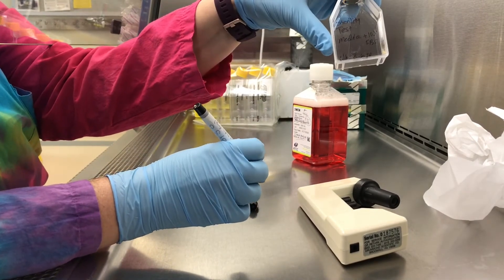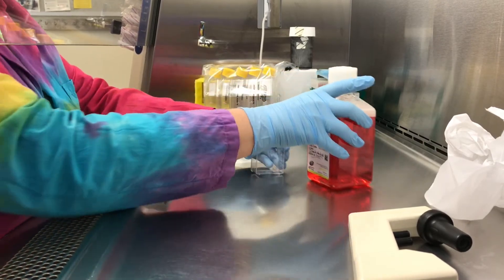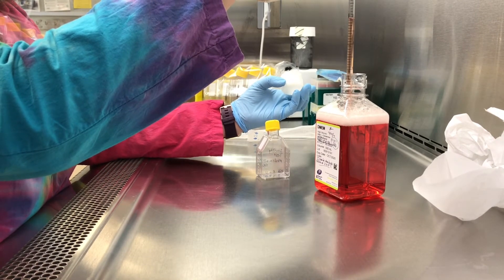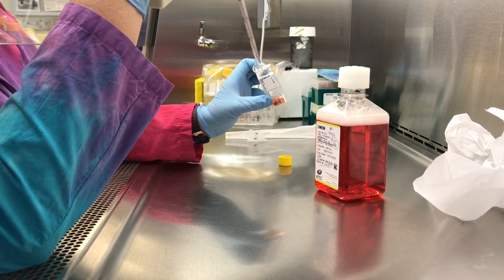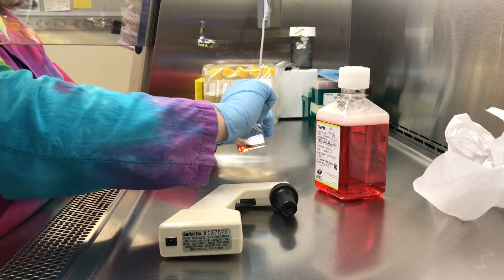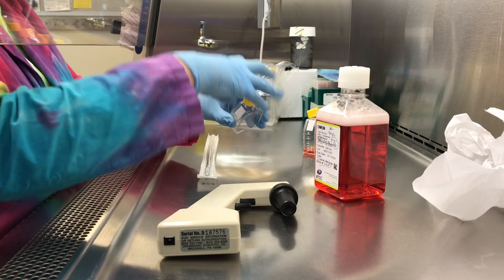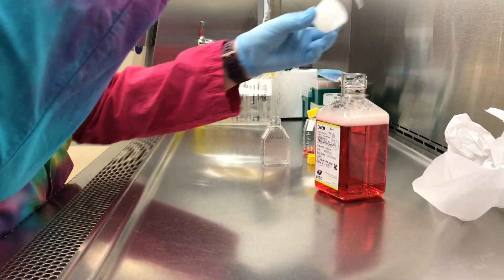As I pipette the media into the sterility test flask, I realize part of my finger may have touched the inside of the cap — and that's really all you need for a contamination event. So I'm not convinced that's going to be a reliable sterility test. I grabbed another T25 flask, labeled it as number two, and I'm going to be more careful this time so I'm not touching the inside of the cap before I reattach it — so that one can be a true sterility test.